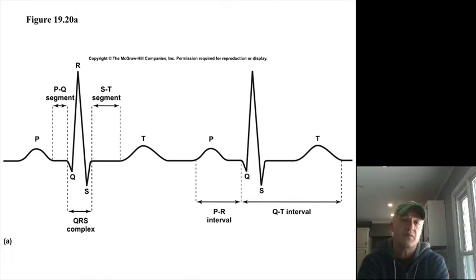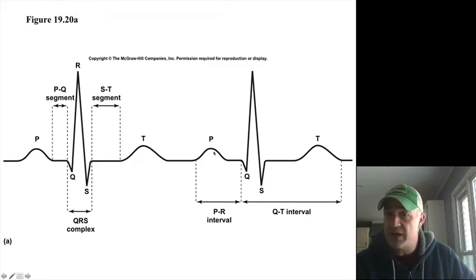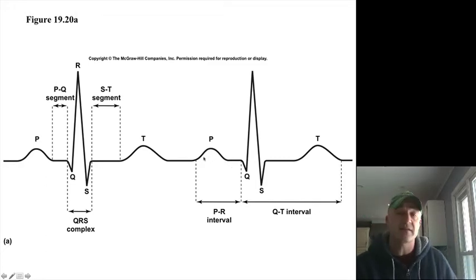So this shows you the PQRST wave. You can see the P wave is a little bump, the QRS is a much bigger complex, and the T wave is again a smaller one. That is getting you atrial depolarization, ventricular depolarization, and ventricular repolarization. The atria do repolarize. If there was no QRS complex, it would be occurring right here. The reason we know it's happening every time is there's always a P wave, since the atria have to repolarize in order to be able to depolarize.